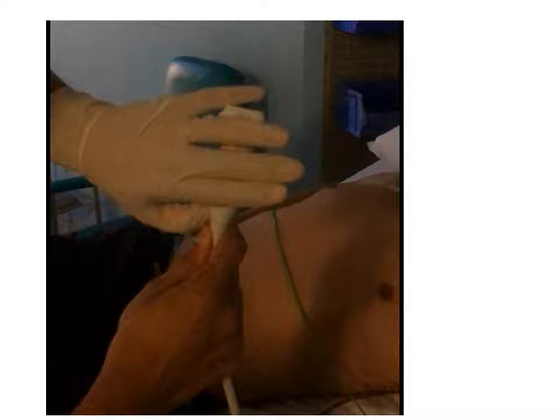Now just a quick word about how to hold the probe. This is certainly one way of holding the probe. This is how I practice and I teach. So what you do is that you hold the probe right up at the junction of the transducer and the cord, and you wrap 3 fingers on one side and put your little finger and thumb on the other, such that the thumb is at the cords.